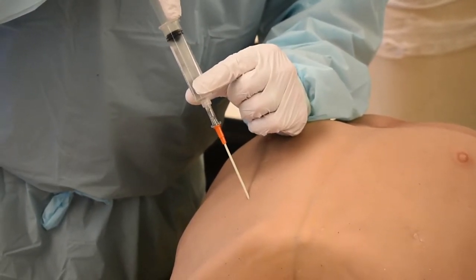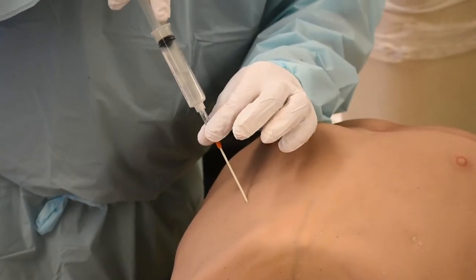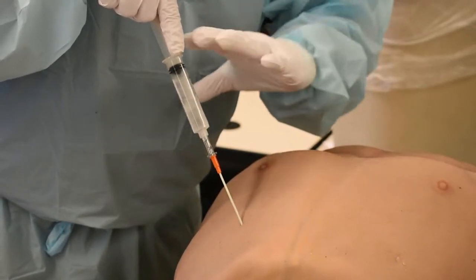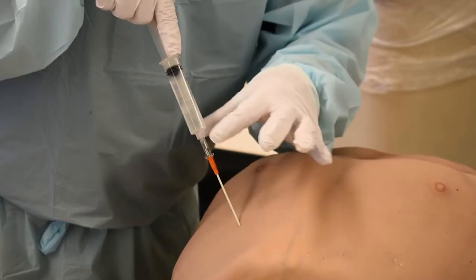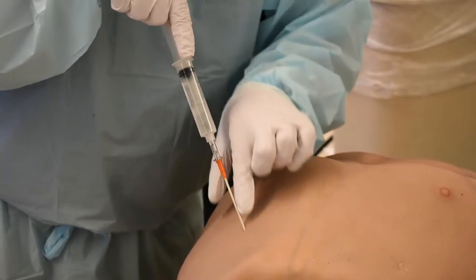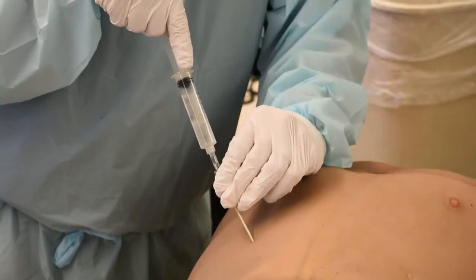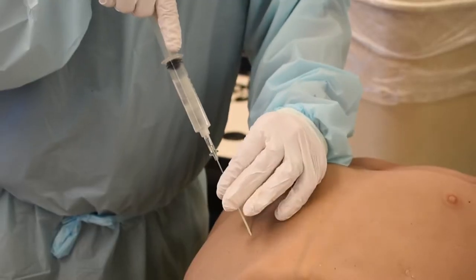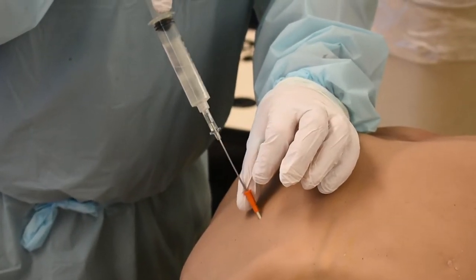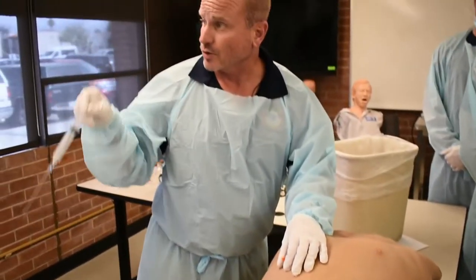I stop because I know my bevel and catheter are through into the chest cavity where I need to be. Just like our needle technique — let's take out all the little things that can mess us up — I use the 14 gauge needle itself as a guide rod. I hold my needle in place and start floating my catheter into the patient's chest. I'm not driving my needle any farther forward. Now I can pull my needle back — it's a sharp, it goes right in your sharps container.